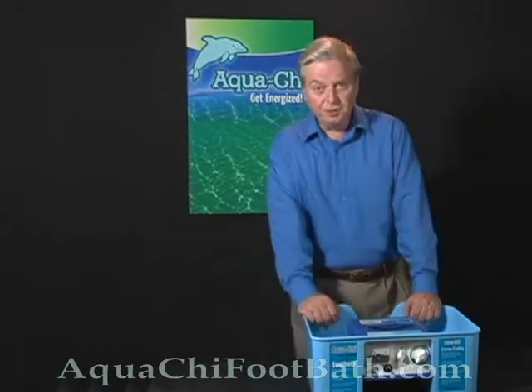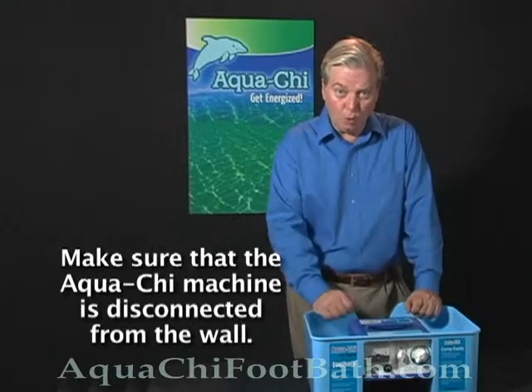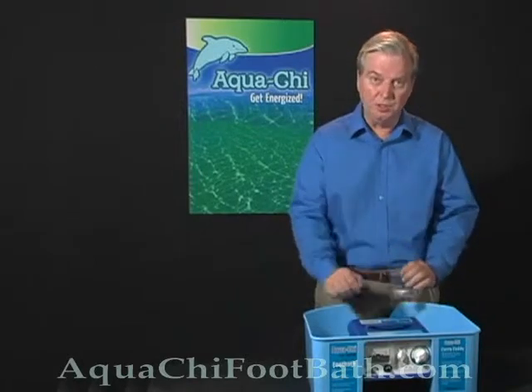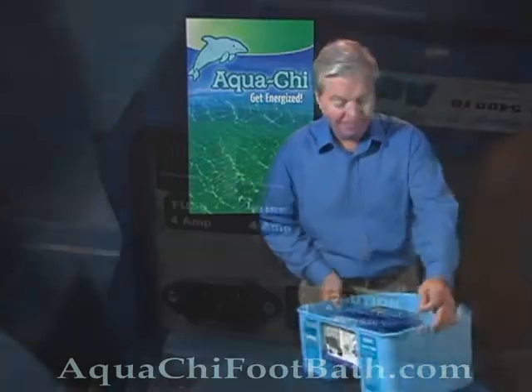Now before you change the fuses, and this is very important, make sure the machine is disconnected from the wall. Now your Aqua Chi came with 2 spare fuses. We'll use these to replace what's in the machine, regardless of how they look. All right, let's go ahead and change them.